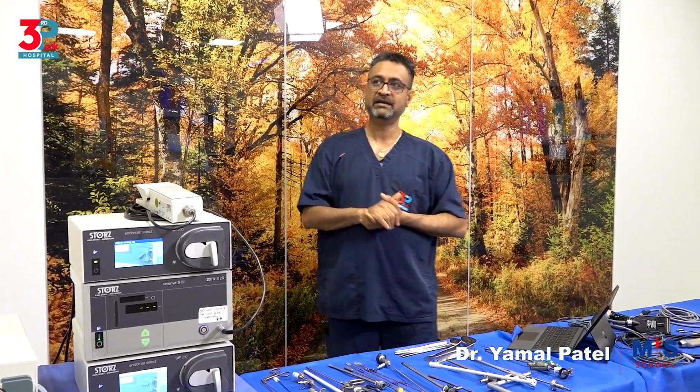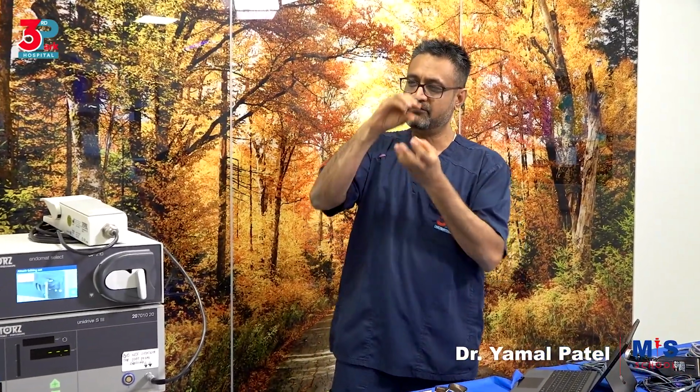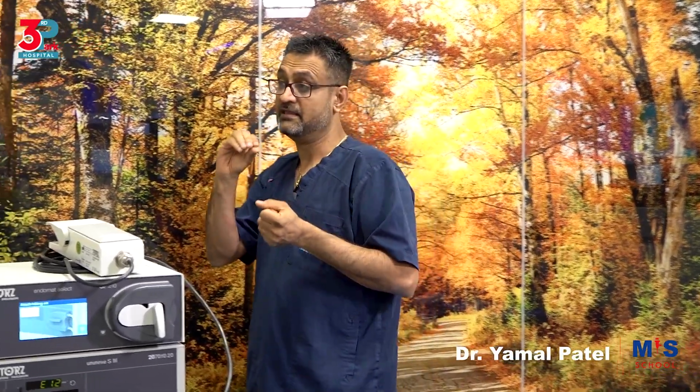So remember, in hysteroscopy we are working in a very small cavity in the uterus, which can also intravasate fluid through the vessels and the tubes, and it will have leakages. So how would you know how much fluid the patient has taken in? And if you are not sure of that, you will likely end up with overload of fluid, which is dangerous.